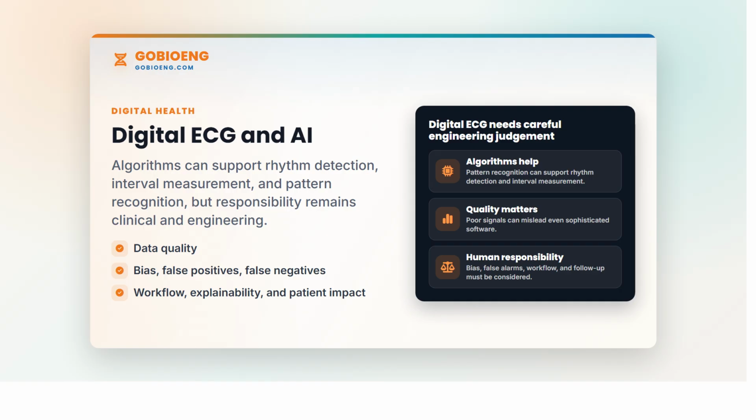Fourth, artifacts can look clinical, so acquisition quality matters. Fifth, wearable ECG is useful, but it does not replace a clinical 12-lead ECG or medical assessment. And finally, biomedical engineers should understand both the signal chain and the clinical context.